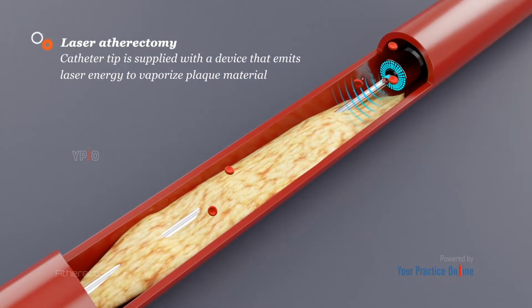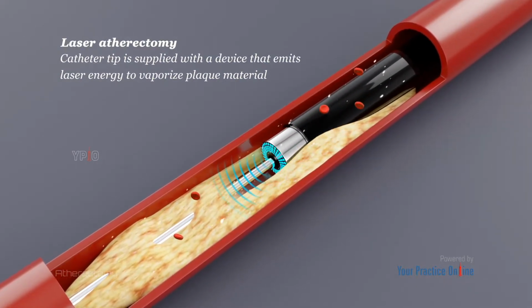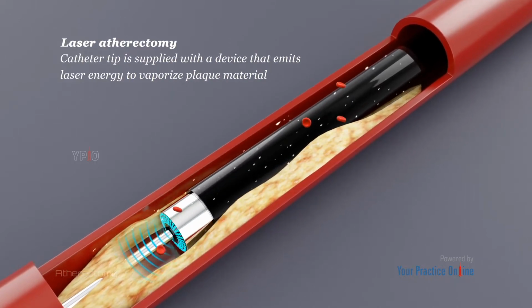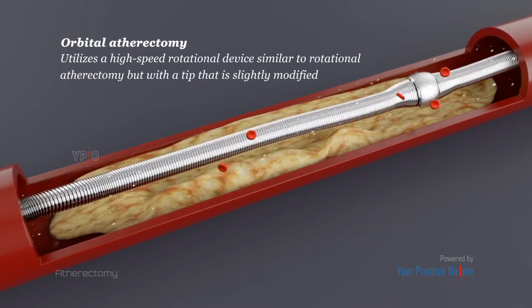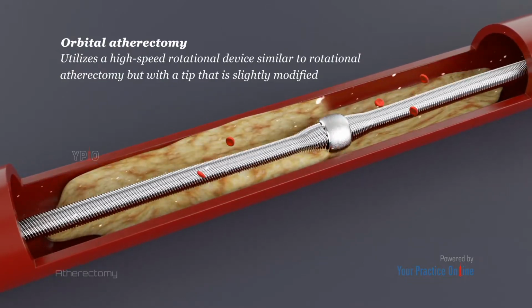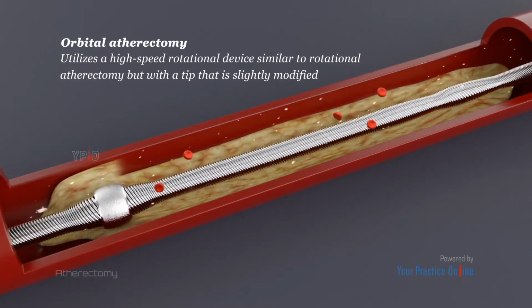Laser atherectomy. In this type, the catheter tip is supplied with a device that emits laser energy to vaporize plaque material. Orbital atherectomy. This type utilizes a high-speed rotational device similar to rotational atherectomy, but with a tip that is slightly modified.